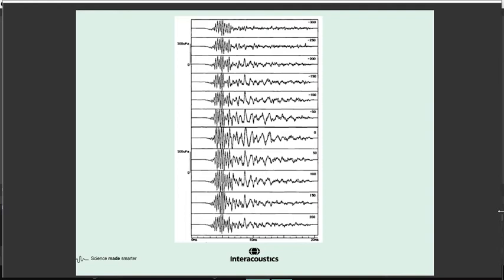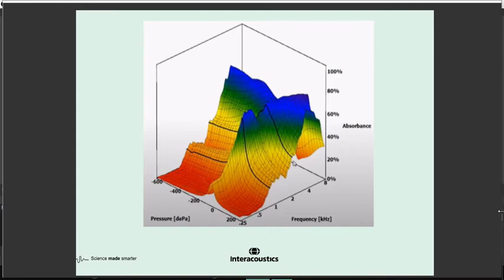middle graph is when it's at ambient pressure. And if you look at around the 10 millisecond point, roughly in the middle of that, you can see the signal is at its maximum size in the low frequencies. At the left-hand side, we're at around 5 milliseconds. The signal hasn't changed very much. And that's because high frequencies still transmit through a more tense membrane than the low frequencies can. So it differentially affects the frequency transmission through the membrane.